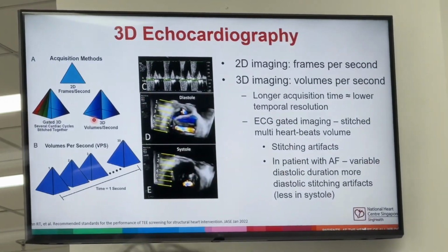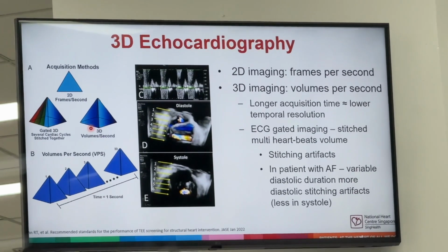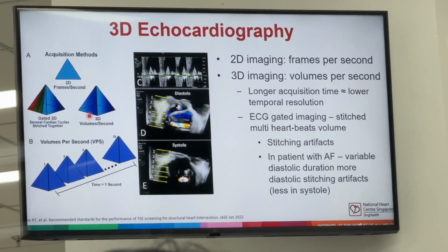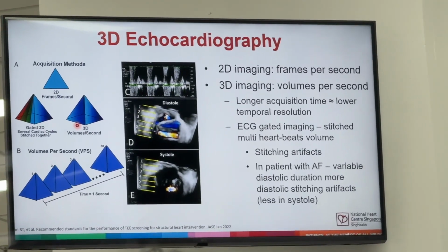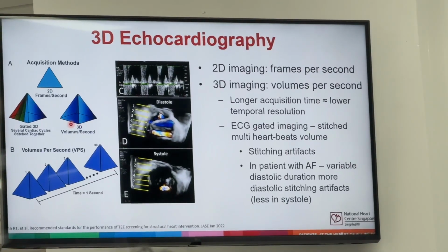So just a very brief overview of 3D echocardiography. In two-dimensional imaging, we take a frame of image, and we have what we call frames per second.